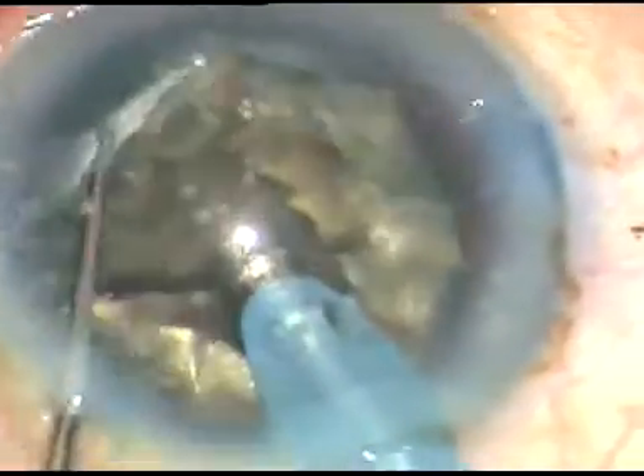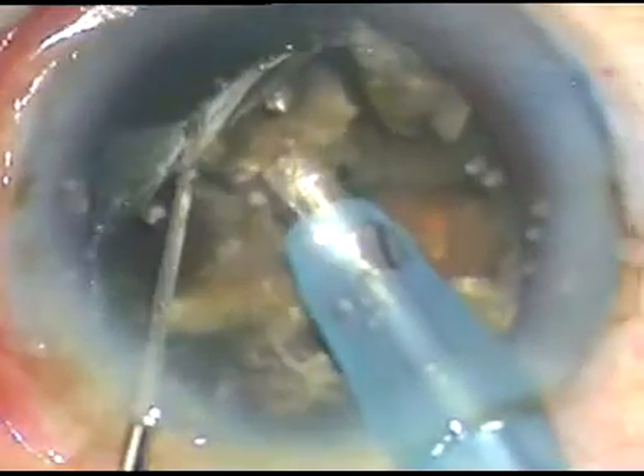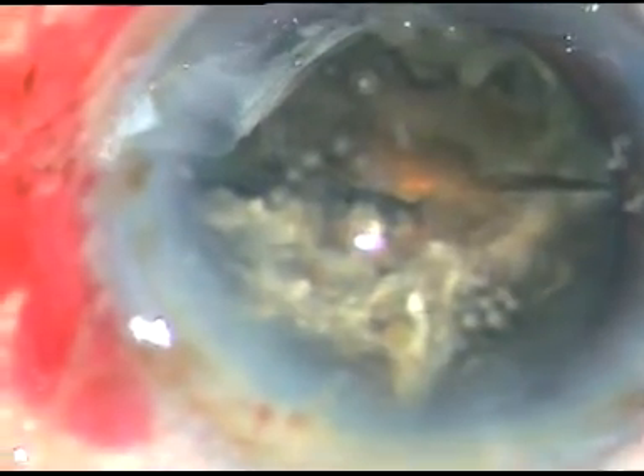Each hemi-nucleus is being chopped again to divide it into two parts. This is the other hemi-nucleus. Each hemi-nucleus is now being emulsified with ultrasonic energy. The phaco energy being used in Phaco 2 mode is 85%, flow rate is 40 ml per minute, and vacuum is 450 mmHg.